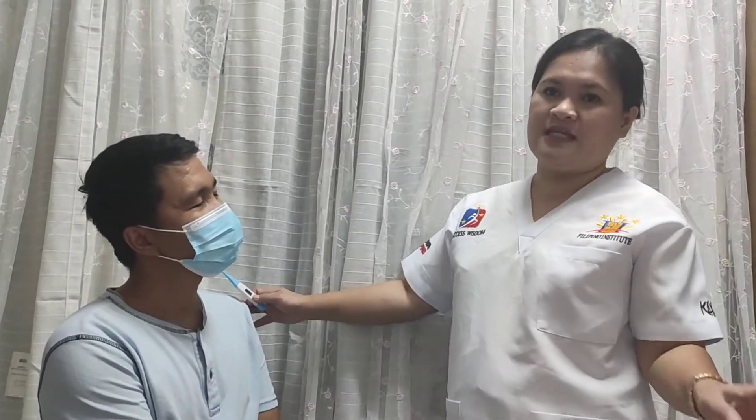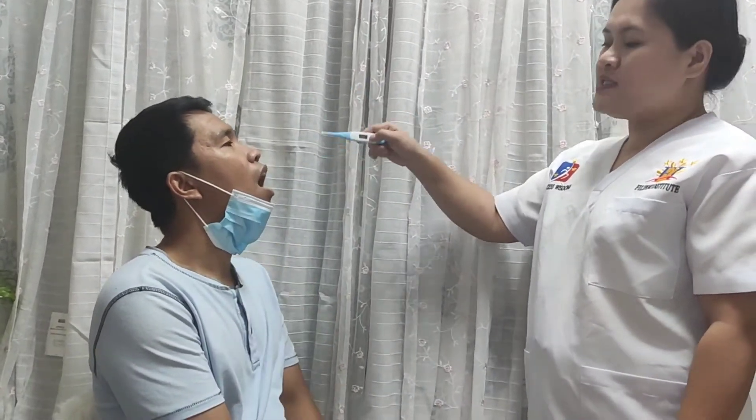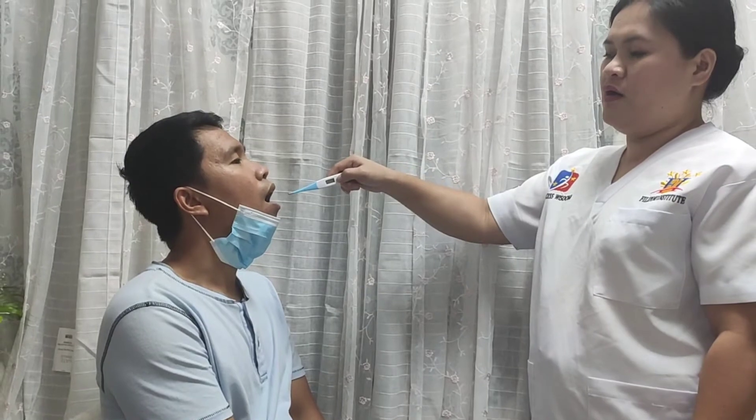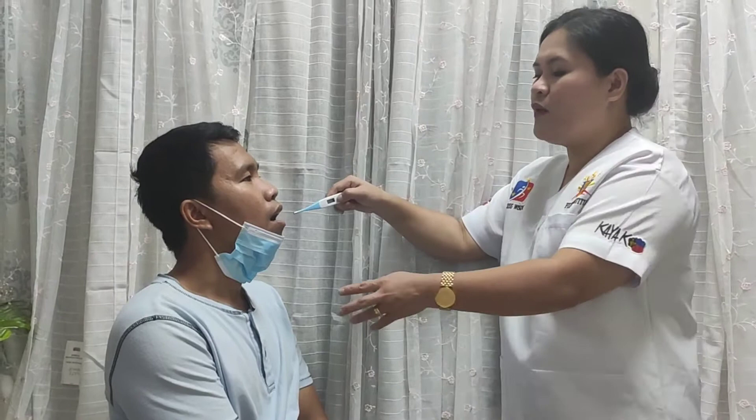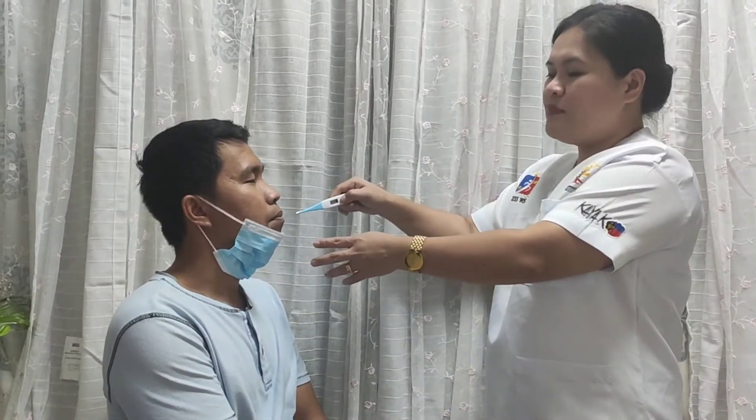Using the oral thermometer: position the patient properly. Ensure that the patient has not drunk hot or cold beverages, smoked, or chewed gum for the past 20 minutes. Ask the patient to open the mouth and raise the tongue. Place the oral probe tip on the tongue base on one side. Ask the person to lower the tongue and close the mouth. Wait for the beep tone and document the result.